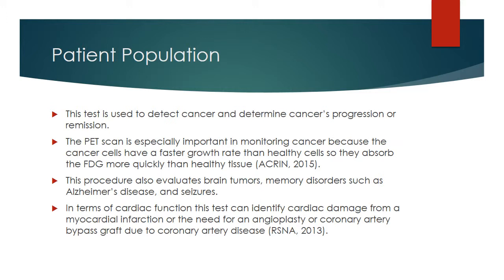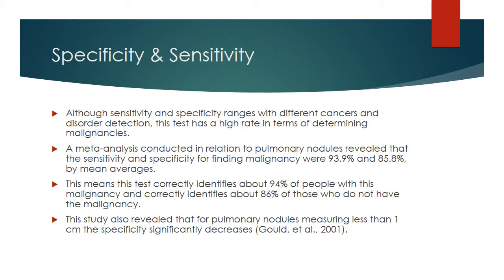This procedure also evaluates brain tumors, memory disorders such as Alzheimer's, and seizures. In terms of cardiac function, this test can identify cardiac damage from an MI and the need for angioplasty or coronary artery bypass graft due to coronary artery disease.